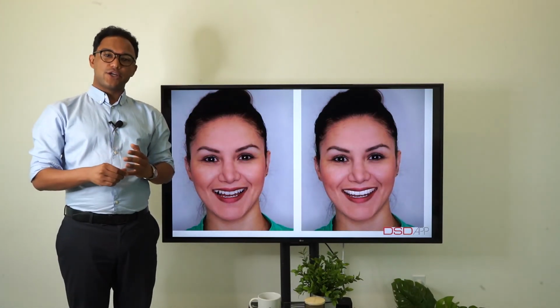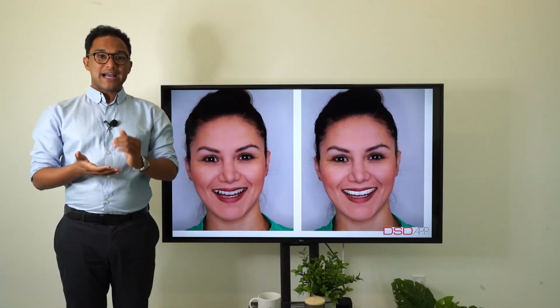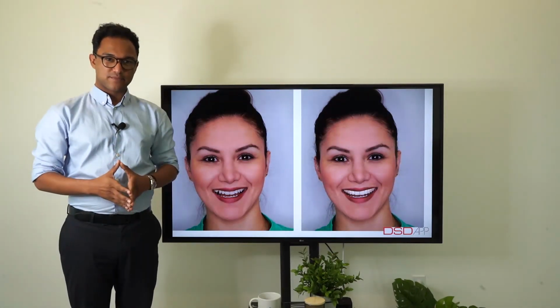By designing smiles for your patients, you are adding 3 unique benefits to your practice. Better visual communication to educate your patient on their oral health and treatment options. New brainstorming methods for your treatment planning guided by the facial and dental structures of your patient. And shareable lab documentation to expedite your turnaround time and increase efficiency.